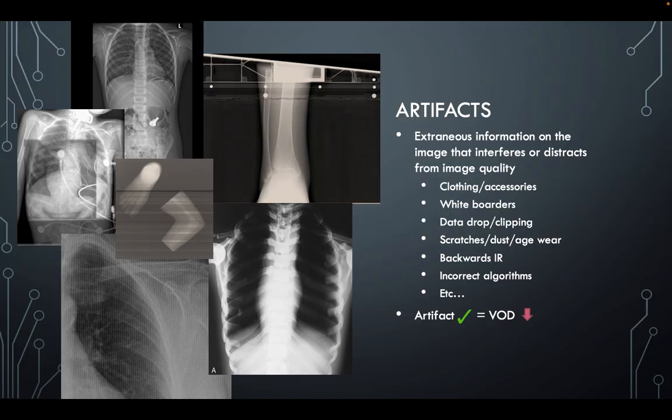And so what ends up happening is when the histogram gets equalized, it starts clipping out values that I actually want to see. And so it'll clip out maybe my iliac crests or my ASIS. And that information will just be gone. It'll look like the pelvis is kind of eaten away at the top.